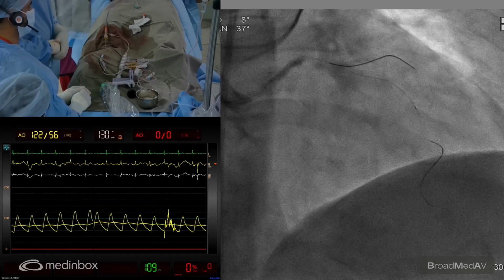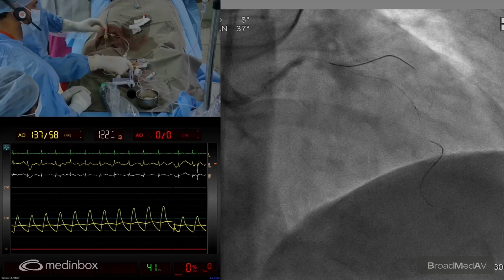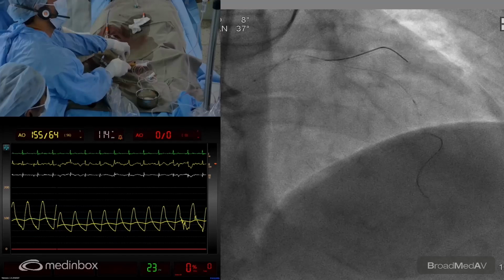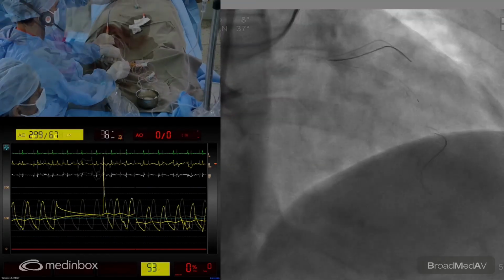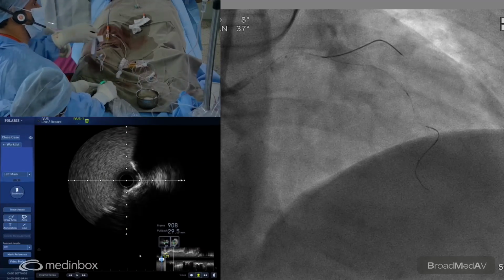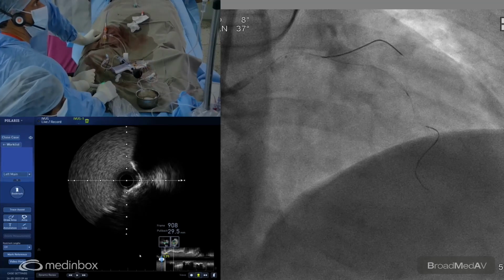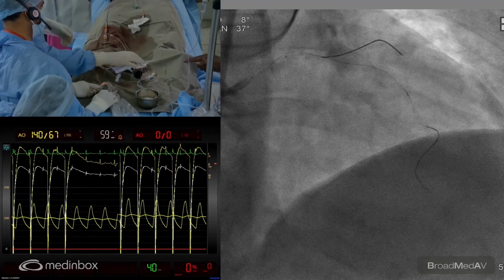The next round we'll do the full 10, please, because let's hope that he can tolerate the pressure as well. Okay, let's take a small shot here. So we're getting to the next round, and now we are at 4, and yeah, now you press. 3, 4, 5, 6, 7, 8, 9, 10. Okay.